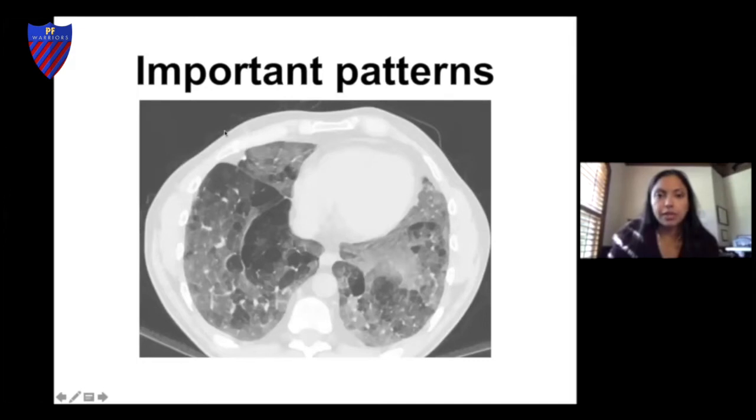So this is an example of what we call air trapping, in a patient that I've taken care of in the past. What we're seeing here is that in the abnormal areas of lung sponge on either side of the heart, there are different spots when this patient breathes out that are different colors. The different colors relate to how effective or not that patient is at getting air out when they breathe out. That arrow points at certain spots where that's happening.